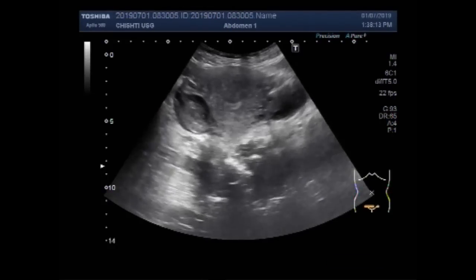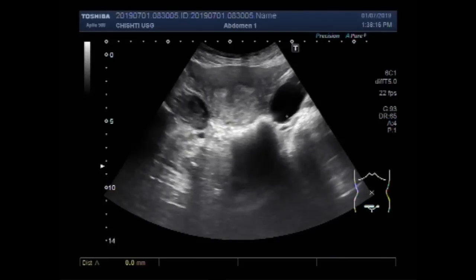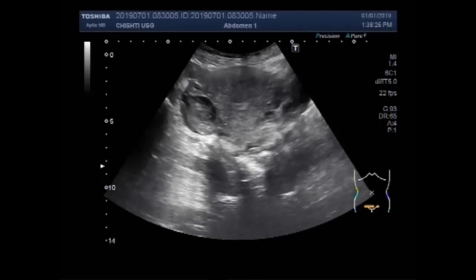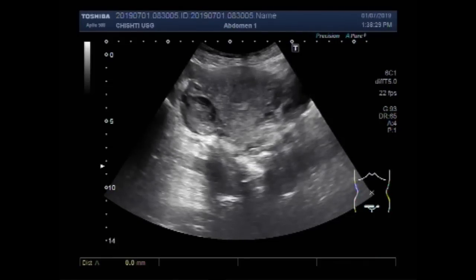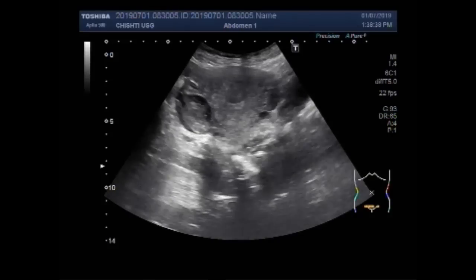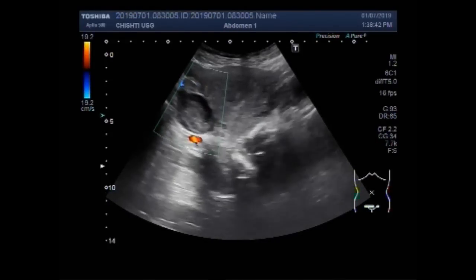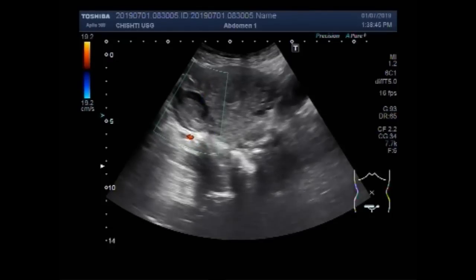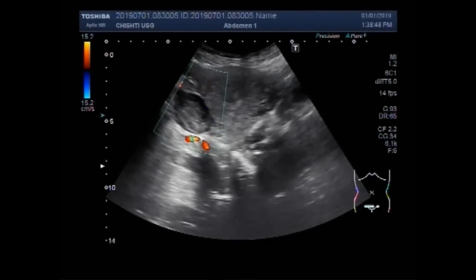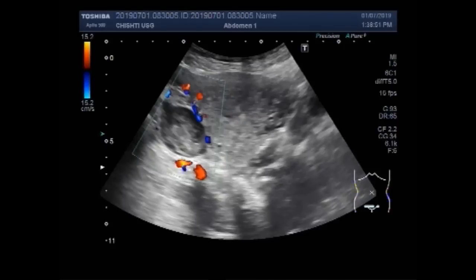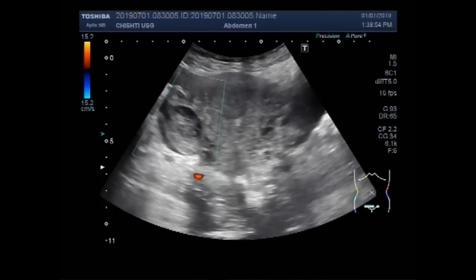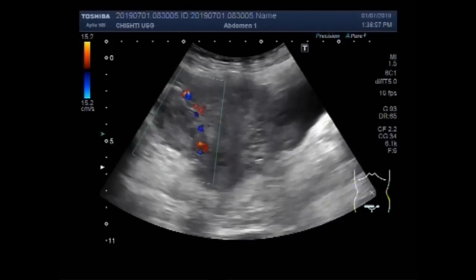The right ovarian cyst is round to oval in shape, has clear fluid in its interior, and measures about 34.4 mm x 28.8 mm. The left ovarian mass measures about 34.6 x 26.4 mm. It is round to oval in shape, semi-solid to solid in consistency, and has nearly homogeneous echogenicity. No fluid is seen in its interior and no significant blood flow is visible.